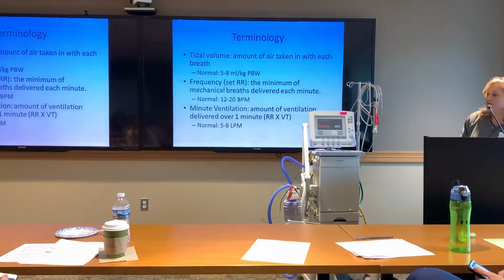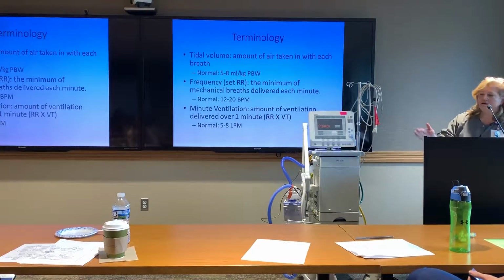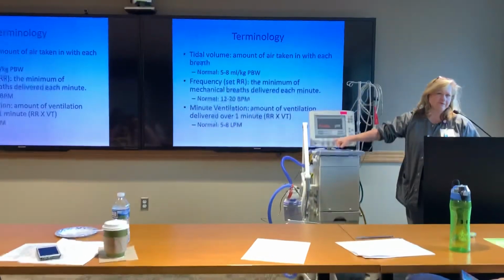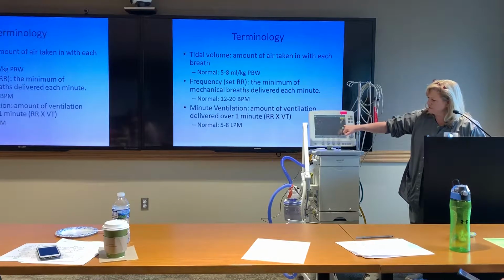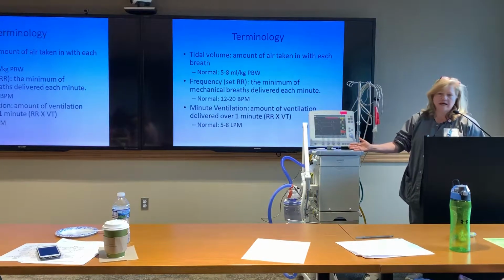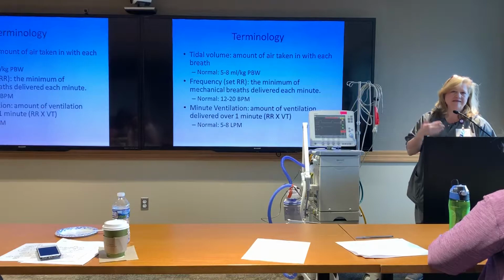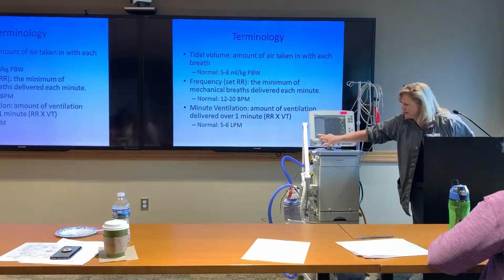Anyway, the frequency refers to the mechanical rate that's set on the ventilator, and we have that compared to the total respiratory rate. Now, not all vents call it frequency. They might call the set rate down here, it'll say respiratory rate, but over here, you'll see your total respiratory rate show up there, right? So if the patient's breathing over the set rate, then the total rate will be higher, all right? Anyway, so they may not always be the same. So sometimes if you're reading material on it, you might hear the term frequency, and that's what they're referring to, the set mechanical rate. I'm just going to pause this because I don't really want it to start making noise.